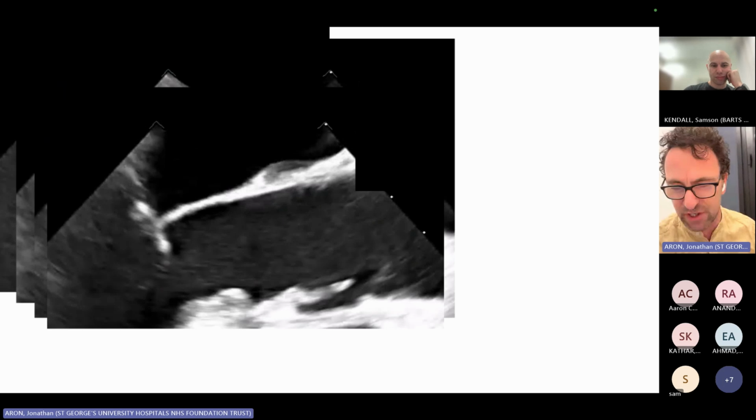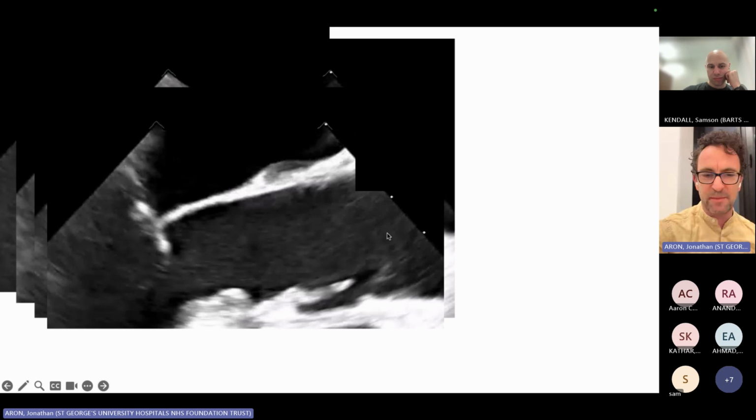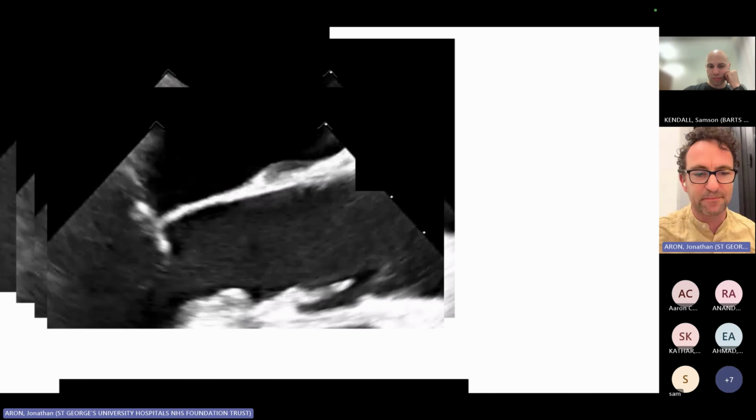Oh, well, this is interesting. So you can see now that the folded mitral valve, the anterior and posterior leaflets, instead of sitting in the cavity nicely, seems to have been pulled into the left ventricular outflow tract. In fact, it's almost obstructed half of the whole diameter of the left ventricular outflow tract. But no biggie, it still seems closed, and the aortic valve is still open. So if the aortic valve is open, it means there must be blood flowing out of the heart. So maybe it's not that bad.